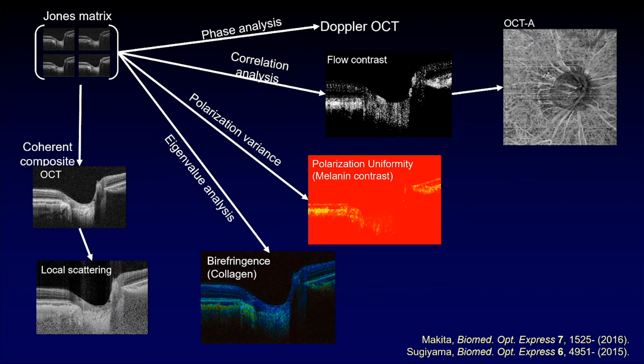Okay, that is the concept of the Jones matrix OCT, and it's still growing and growing. But at the basic framework, or basic concept, the Jones matrix OCT measures the most general quantity and derives anything after the acquisition. It's a way of thinking. Okay, it's kind of my style. Having a general representation and a specified layer is actually my very basic attitude for anything.